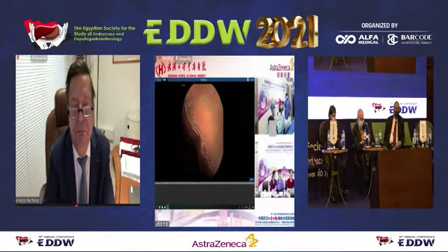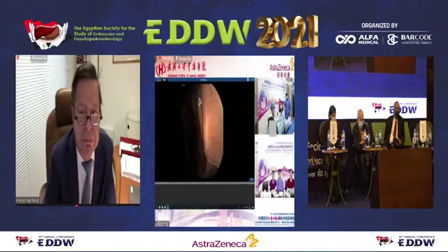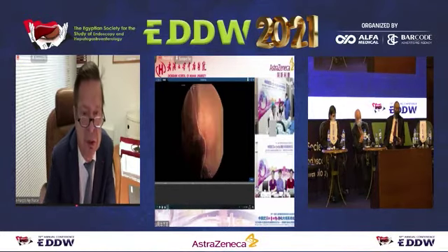Yeah. And Dr. Zhou asked the patient to drink water because the fold is too deep. We want to drink some water to expand the cavity.